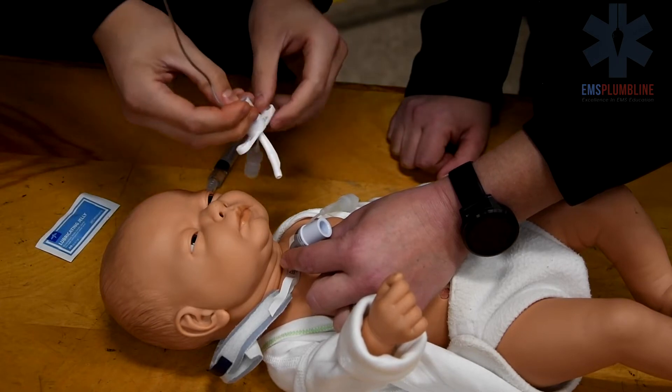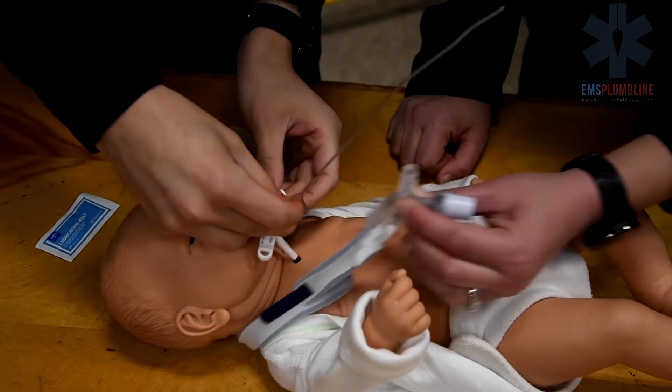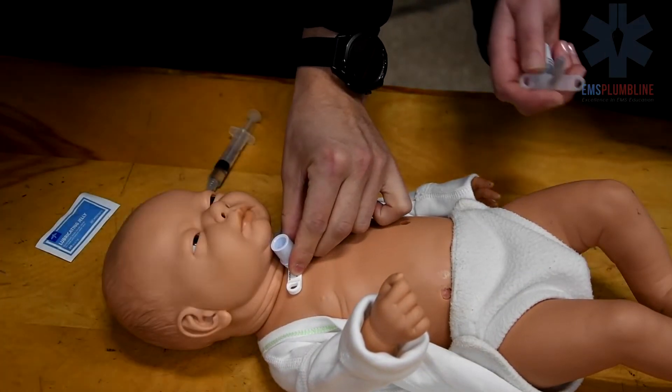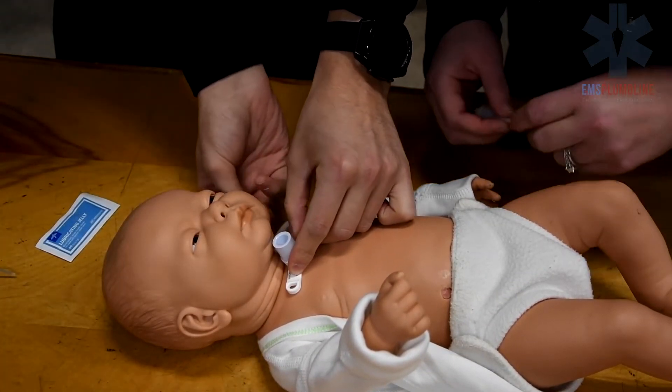Count to three with your partner to perform the trach tube change. Immediately remove the stylet. Hold the trach tube in place and fill the cuff volume as applicable.